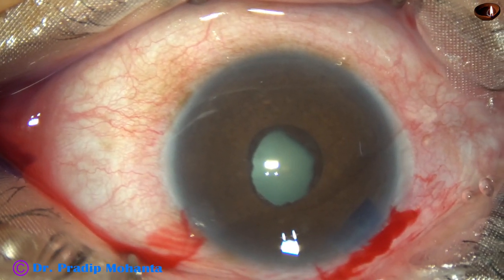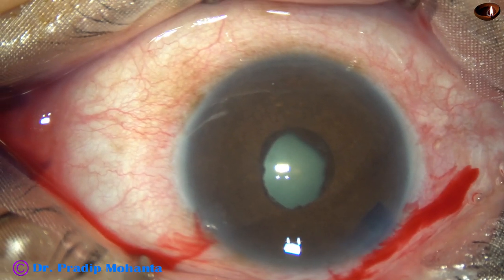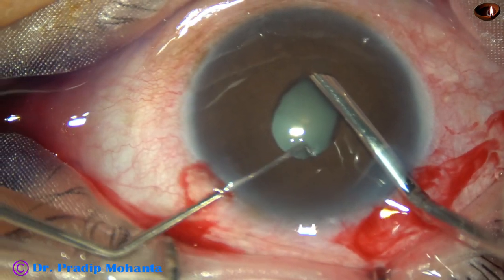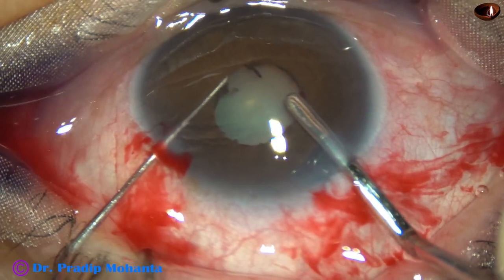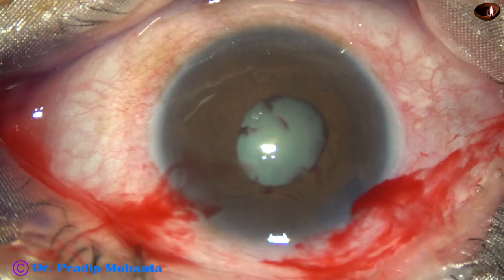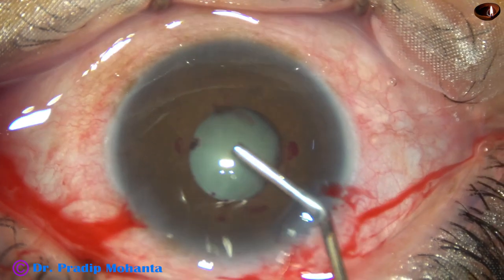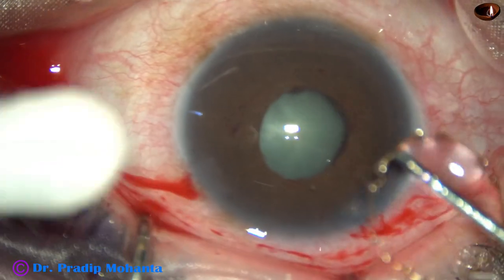For application of PHX we need to stretch the pupil a little bit and make the size of the pupil about 4 millimeter. So I took the chopper and iris spatula, and this much stretching of the pupil is okay for this case. Now some more visco is applied behind the iris to make some room for application of the PHX.